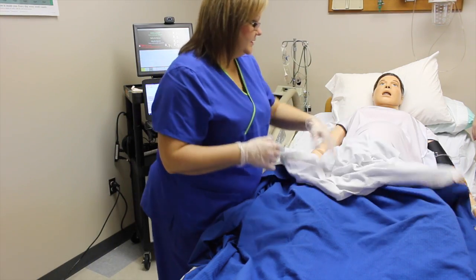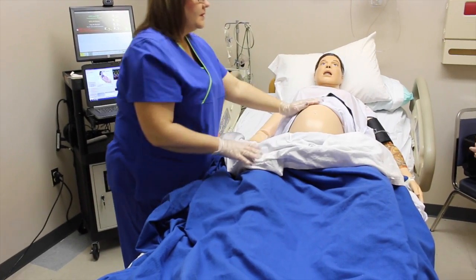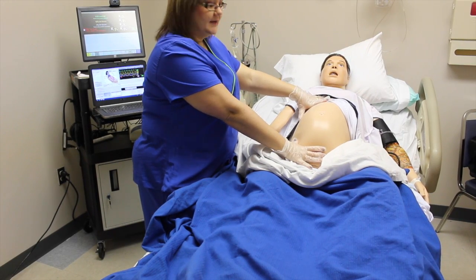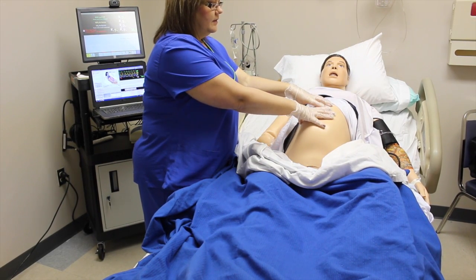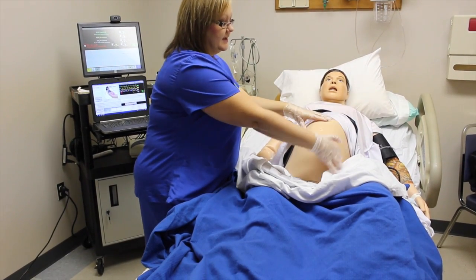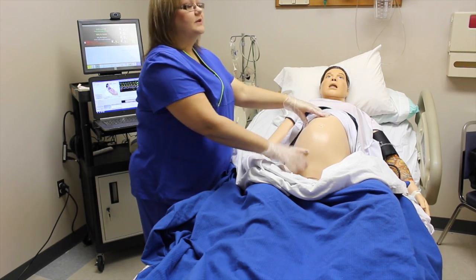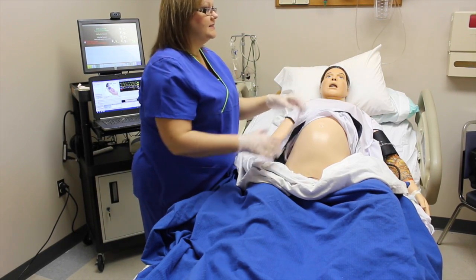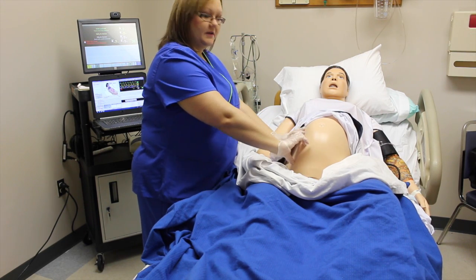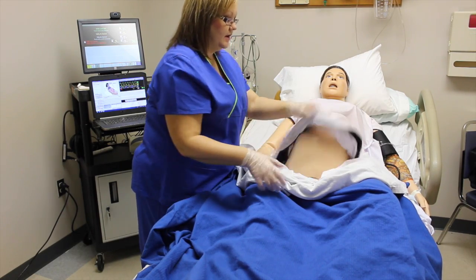When a patient comes into the obstetric setting, what we first do is put on the fetal monitors. When the baby is in vertex position or head down, the fetal heart rate is best found on the fetal back, which is typically this side or this side. As labor progresses, we turn the patient from side to side, in which you'll find the fetal heart tones typically in this area with the external monitor on either side, depending on which side they're laying on.